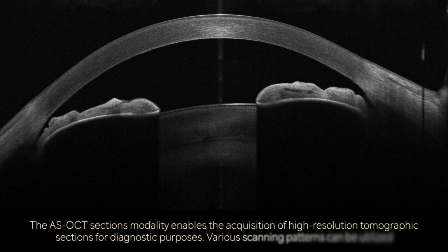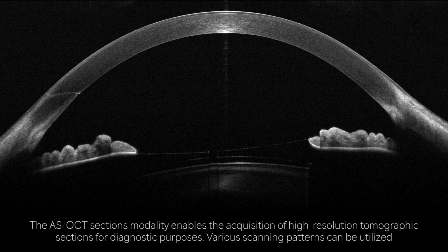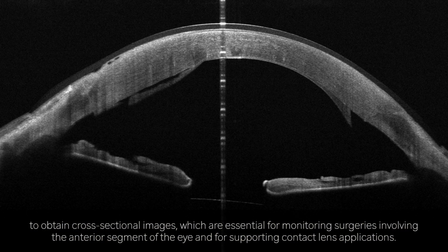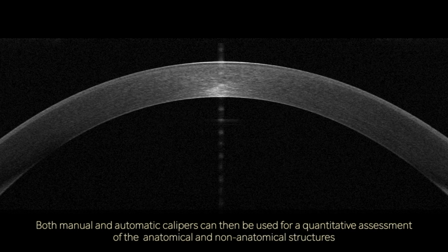The AS-OCT sections modality enables the acquisition of high-resolution tomographic sections for diagnostic purposes. Various scanning patterns can be utilized to obtain cross-sectional images, which are essential for monitoring surgeries involving the anterior segment of the eye and for supporting contact lens applications. Both manual and automatic calipers can then be used for a quantitative assessment of the anatomical and non-anatomical structures.